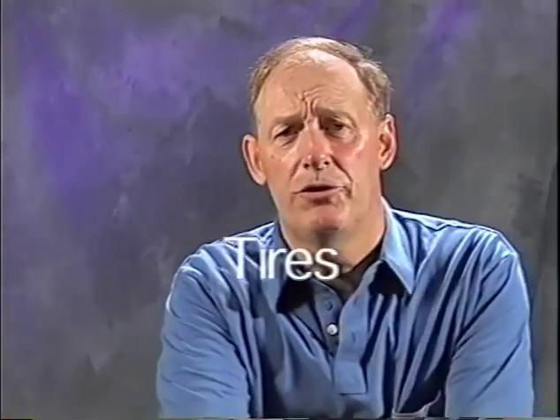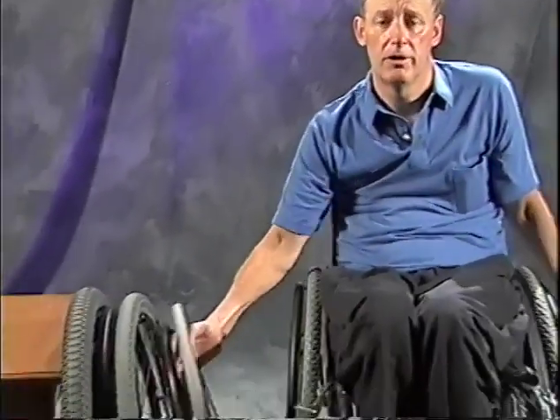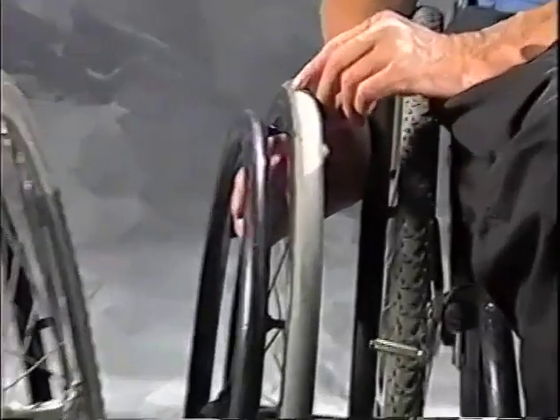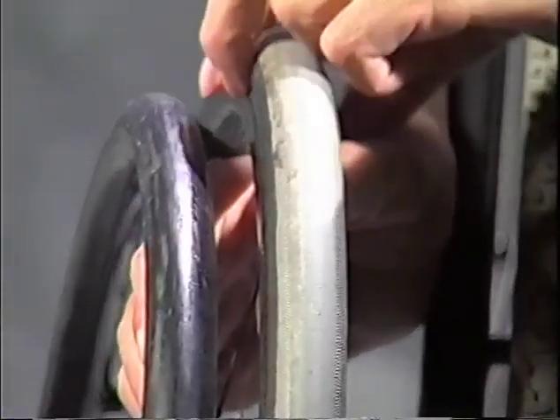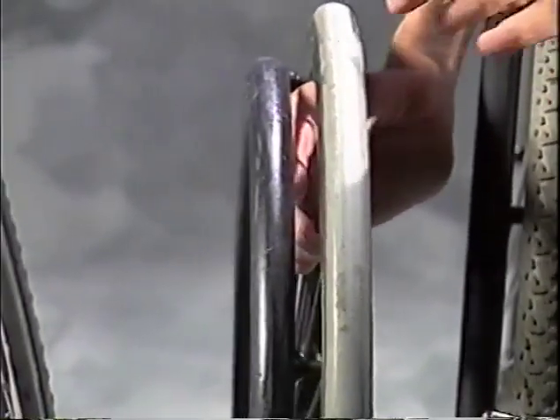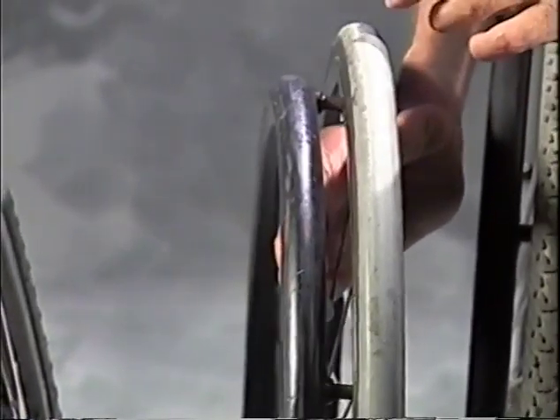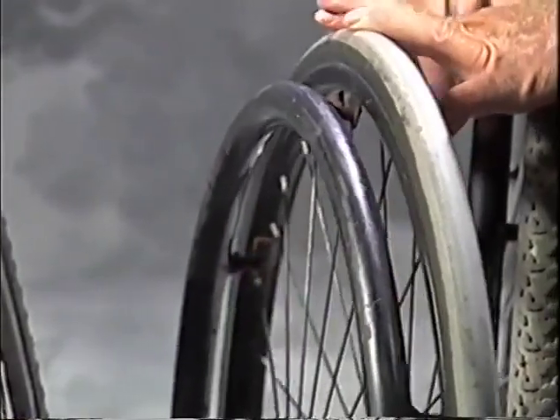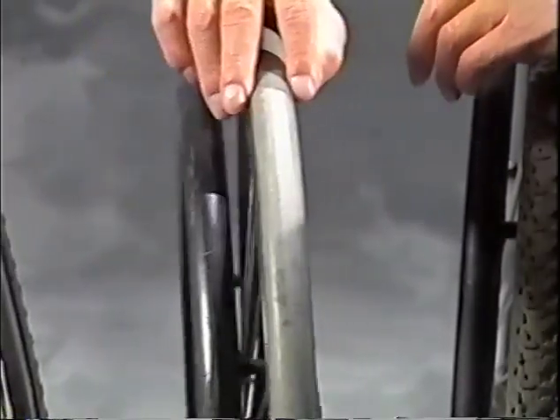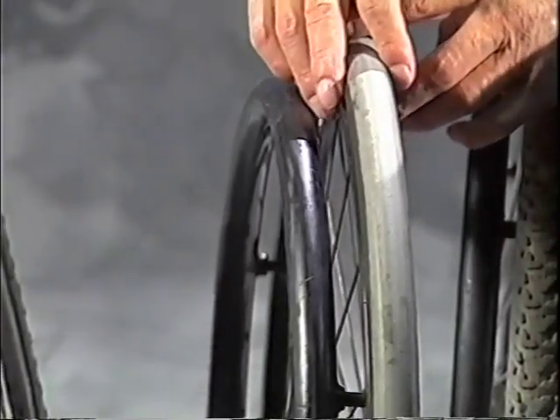When it comes time to choosing tires for your wheelchair, you have a large variety of tires to choose from. The first one I'll talk about is the high-pressure, basically 1-inch wide, narrow tire. This tire is very good for indoor use and sports, such as road racing, tennis, basketball, rugby, that type of sport. It's a more efficient tire. It rolls much better than the other ones. The downside of this tire is it's lousy on the grass or any soft surfaces.